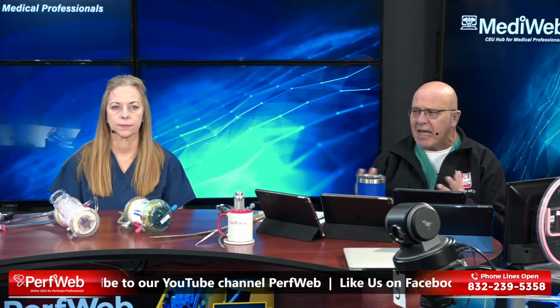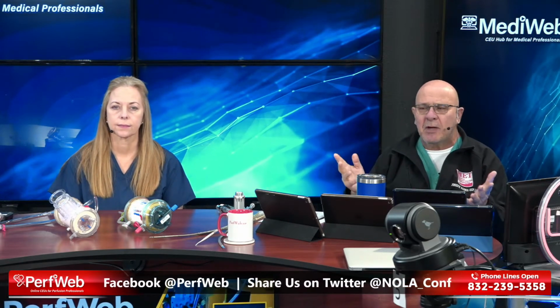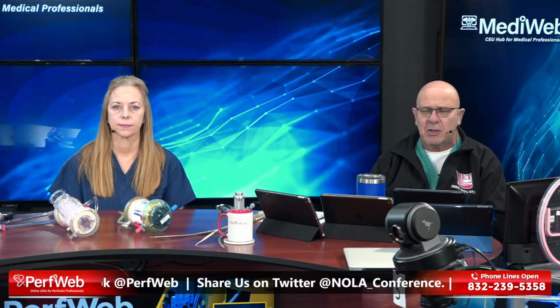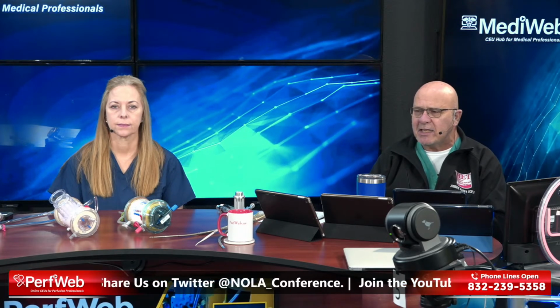You can use this for everything from in-house to transporting to the CT, to transporting via either ground or air ambulance to anywhere that you want to go. So it's a very effective tool. Disappointed that they did decide to discontinue it, but I understand they need to do what they need to do.